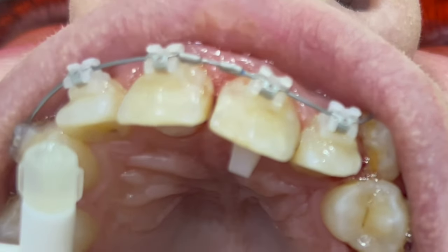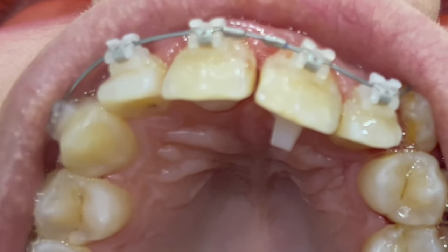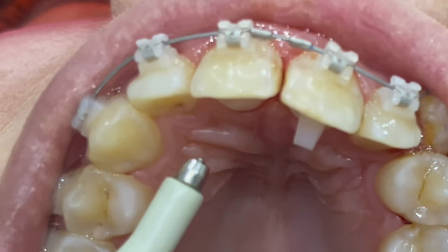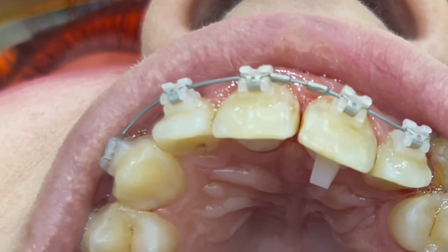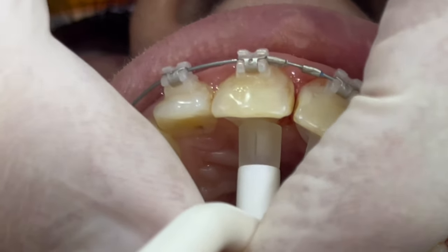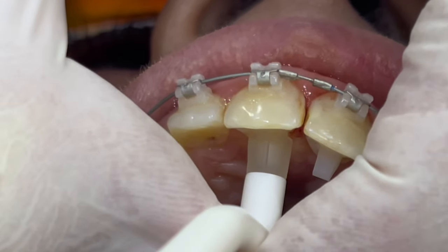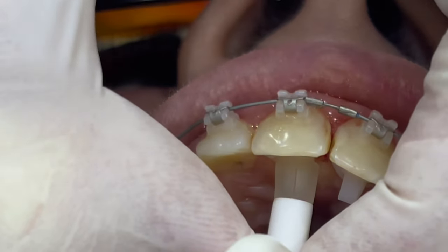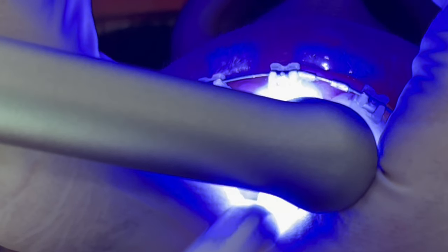The composite mold kit is very useful for such things. After etching, we can insert the composite. I use the bracket bonding composite here, but you can use a filling composite as well, or band lock — any strong composite, not the flowable one. Fix it and simply direct the light from different sides.